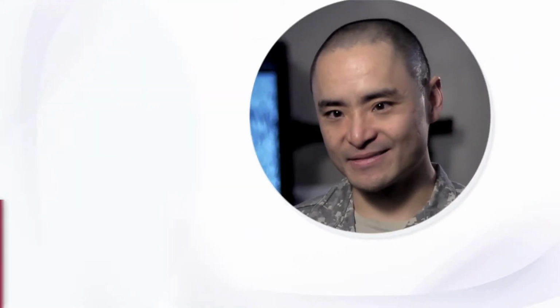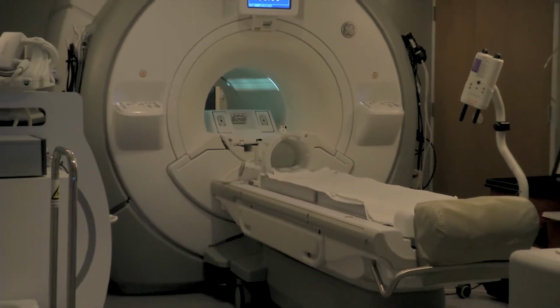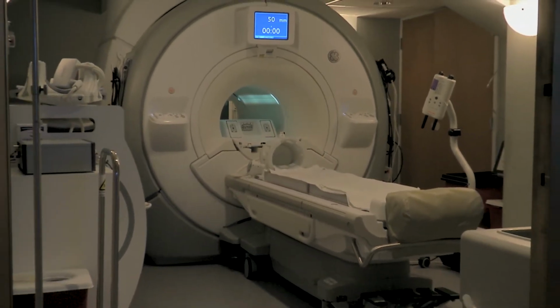So in radiology, there are different technologies that we can use to image the human body, and in our case, the brain. The most commonly studied technologies for studying the brain are going to be MRI, which stands for magnetic resonance imaging, and PET, which stands for positron emission tomography.